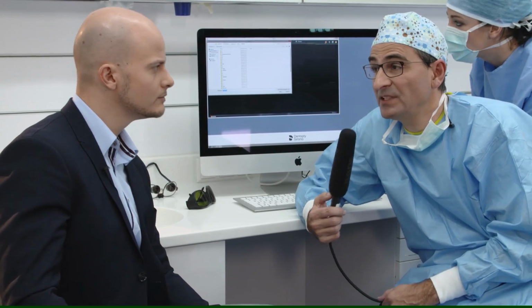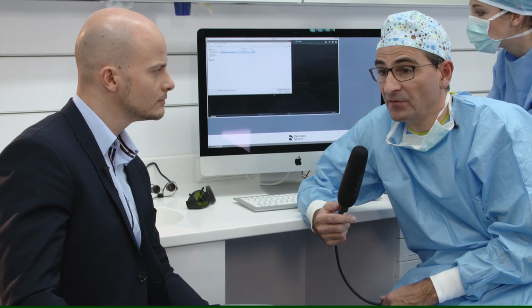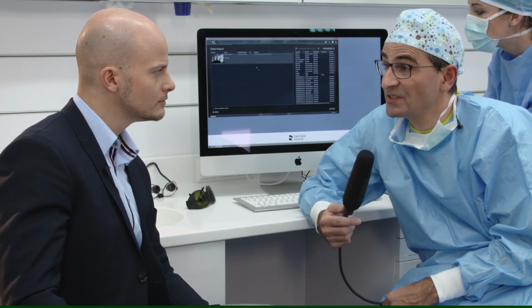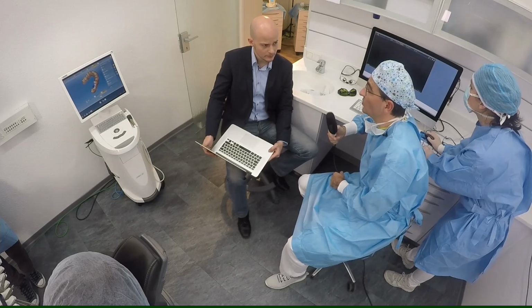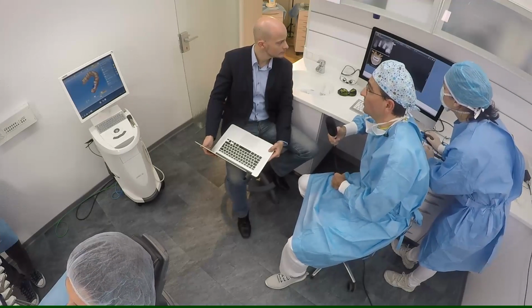And for primary stability, in my opinion, I have a good experience with the Xive system. We have been using it now for about 10 years, and it really looks great.